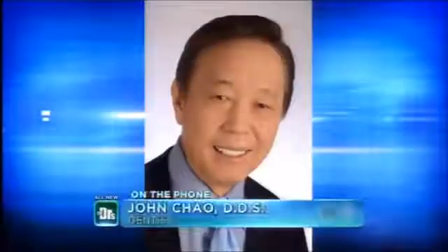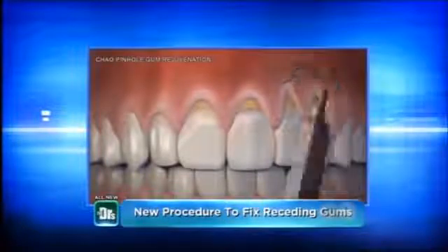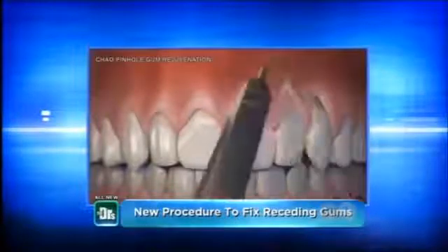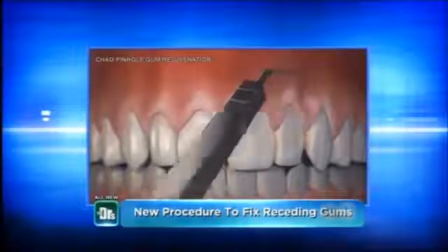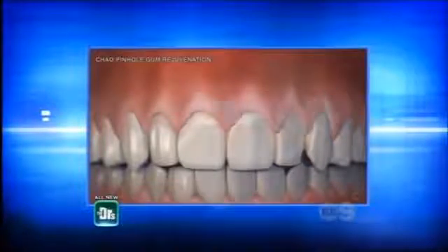I went from the top of the tooth, the area where the tissue is very soft, very, very pliable, and it's full of collagen. So I went through there with a pinhole, and then I basically disengaged the tissue from the underlying bone, and then I was able to basically drape the gums down to where I wanted to go, and then I stabilized it with the collagen strips and put it between the teeth, and that's about it. So the secret is to go from where it's soft, where it's easier to approach the tooth.